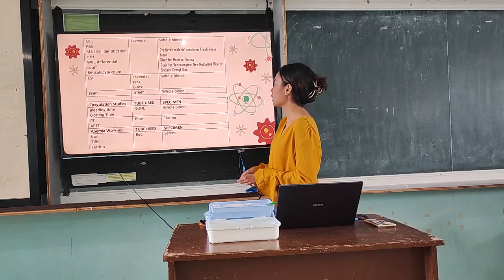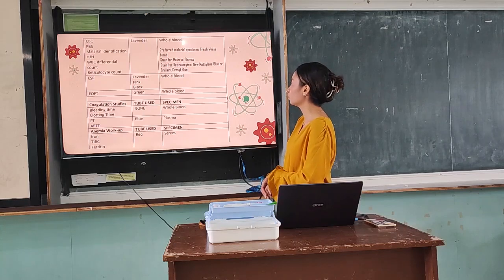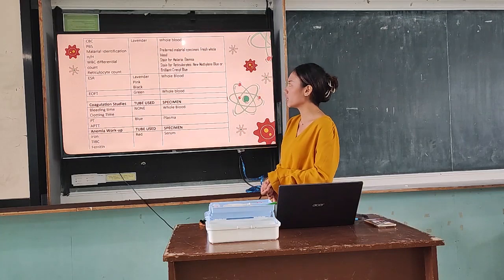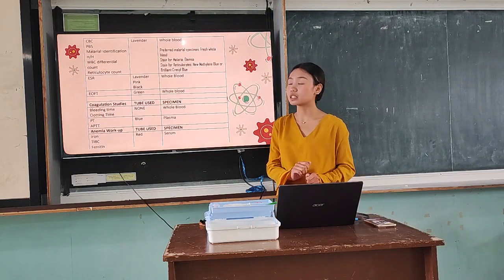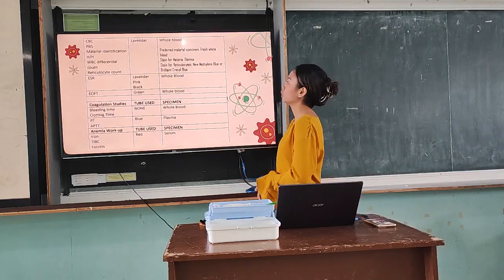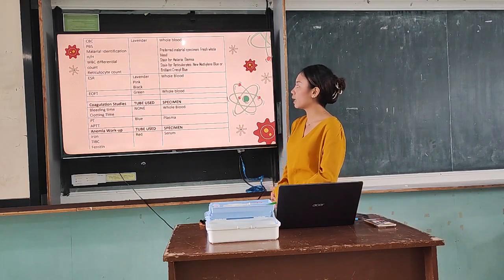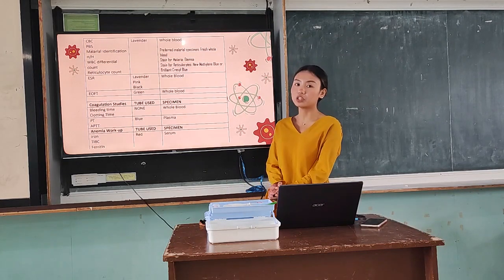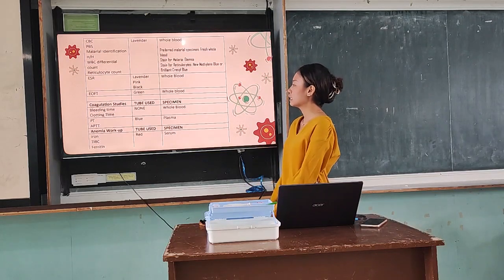And then, ang stain for malaria, we have Giemsa, stain for reticulocytes, new methylene blue, or brilliant cresyl blue. Okay, so sa malaria kasi, preferred yung sa may slide, sa smear kapag malaria. Pero we can still use naman lavender now. Next, we have ESR. You can use lavender, pink, or black. Again, whole blood. We have here the EOFT or erythrocyte osmotic fragility test. We need to use a green top for whole blood.